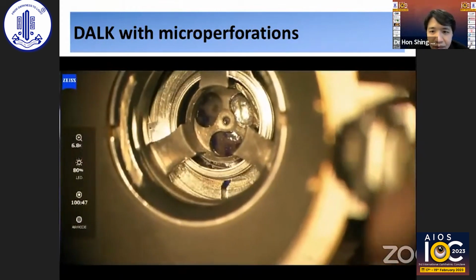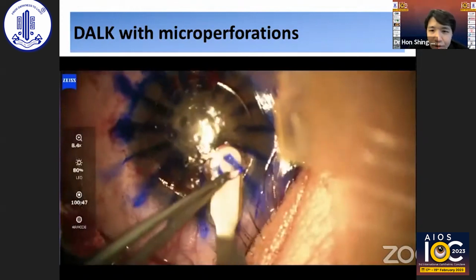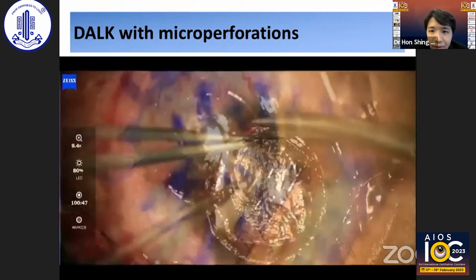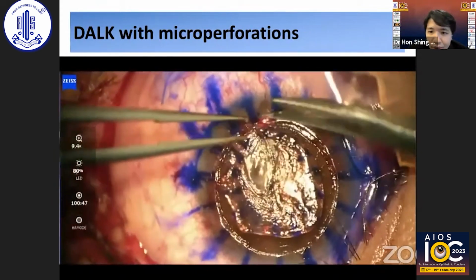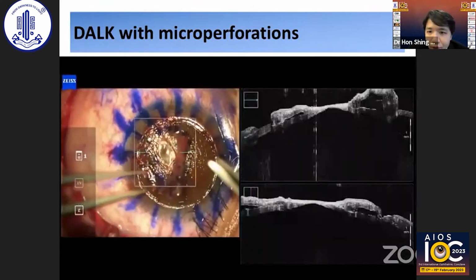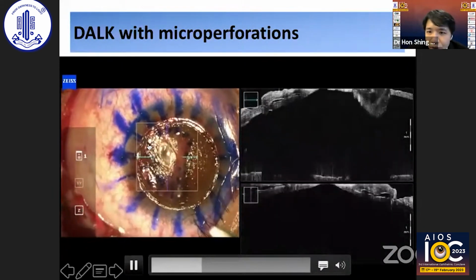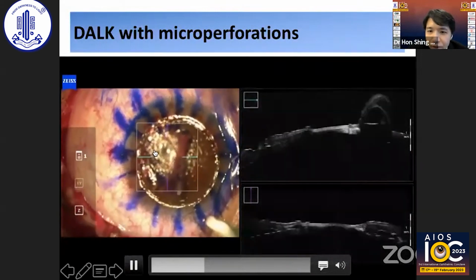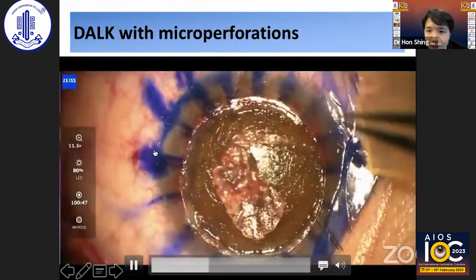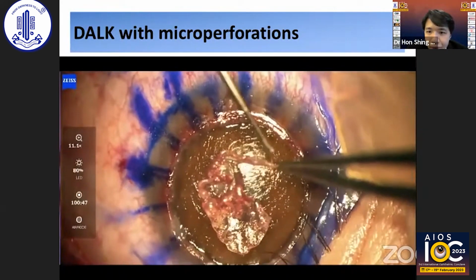And also we use the Hanna trephine to make the initial trephination of the cornea. And then I proceed to take the various layers of the cornea off. So using intraoperative OCT, I know that the central area of the cornea is relatively thin, and this is the area where there was the original perforation which needed gluing. So I avoided these areas and left this area untouched until the end.